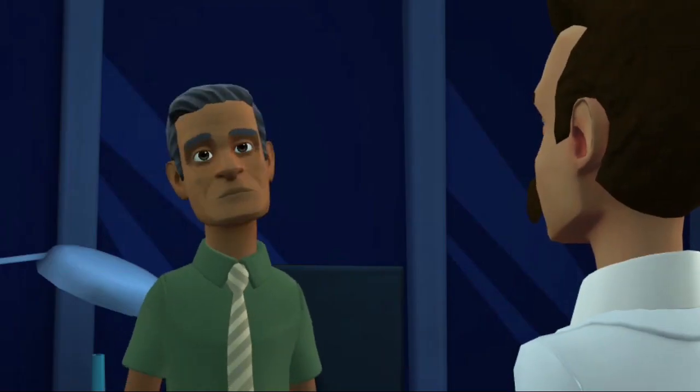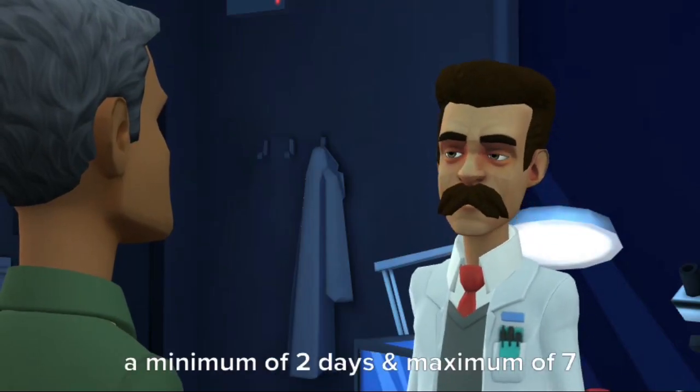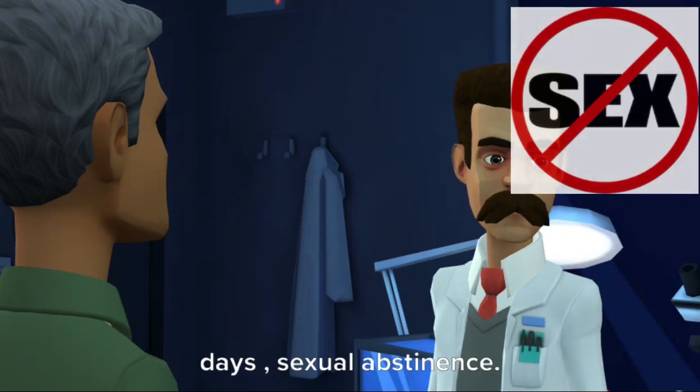Please explain. The sample should be collected after a minimum of two days, maximum of seven days, sexual abstinence.